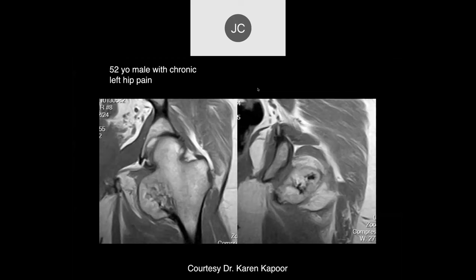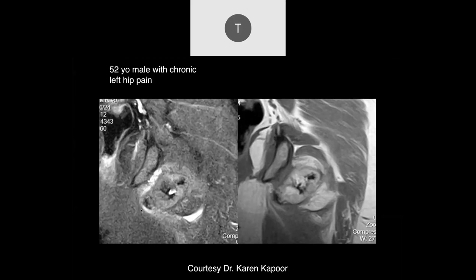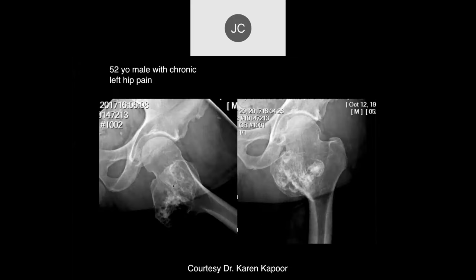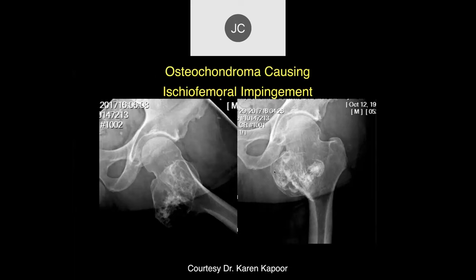It looks like a large osseous exostosis. Here's another example except this time it's on the femoral side, with a typical x-ray appearance of osteochondroma or exostosis, at a point where it can compress the ischial femoral space.